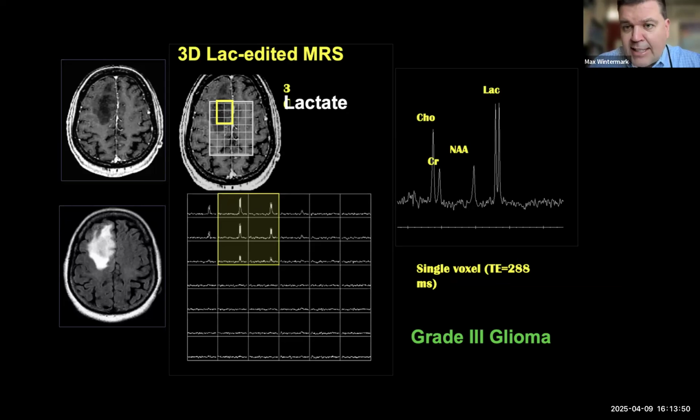In those settings, getting different types of perfusion plus the spectroscopy often helps, but at times you'll get discrepant results, and one technique will tell you it's tumor progression and the other will tell you it's just treatment changes. So overall it helps, but none of them is perfect. When they are convergent, it really increases your confidence, but at times they are discrepant.